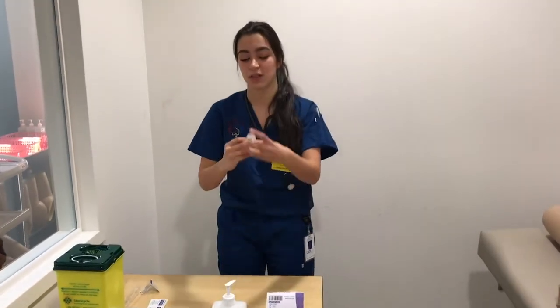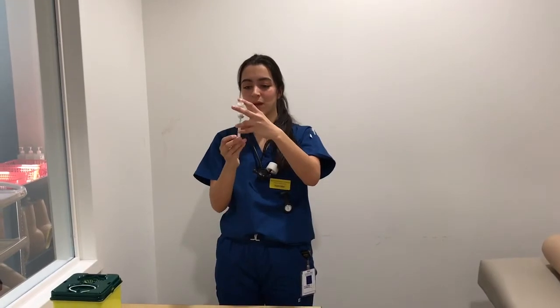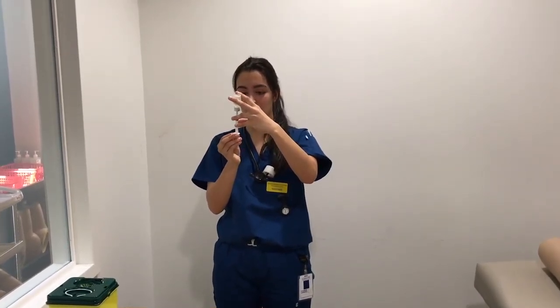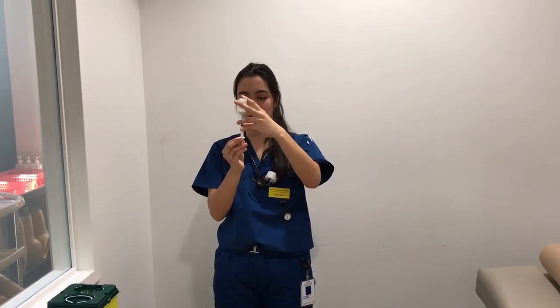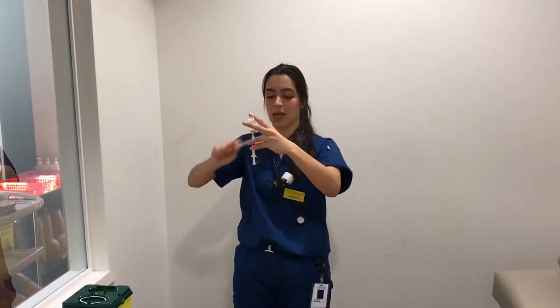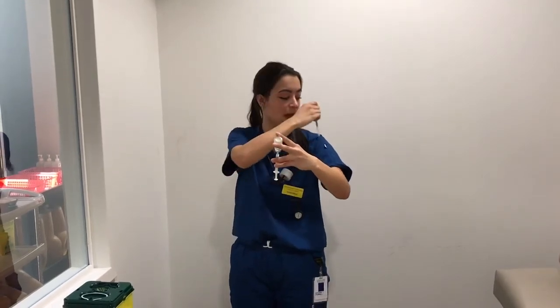So again, positive pressure. You're going to hold the needle in an appropriate position, making sure that you're not going to bend it at all. And you're going to take that 1 milliliter of medication of the expired sodium chloride. And again, I have some air bubbles, so I'm just going to hit them out with my pen.